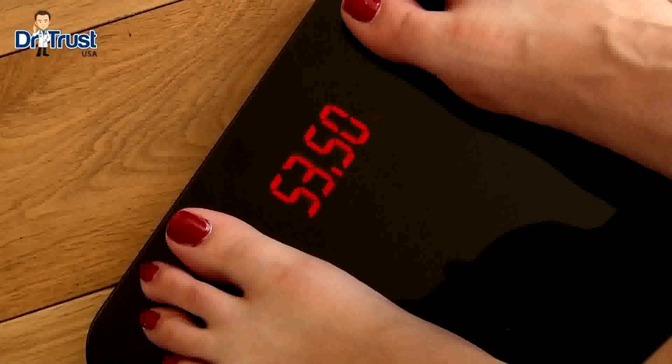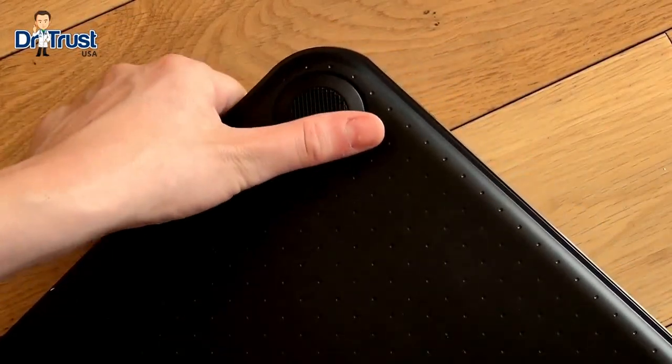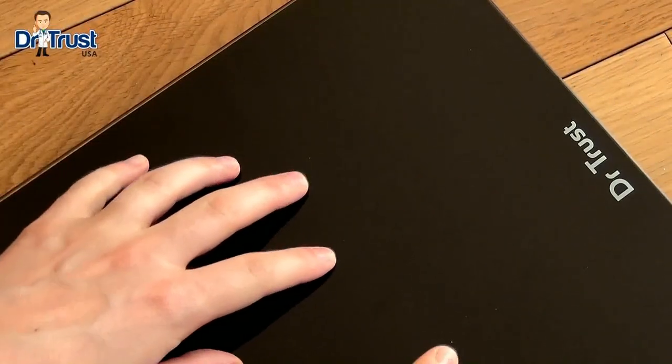The red LED display keeps your weight measurements safe from prying eyes, giving you the privacy you need when tracking your weight and allowing you to weigh any time of day or night. Anti-slip feet are also included for added safety and protection on any surface.